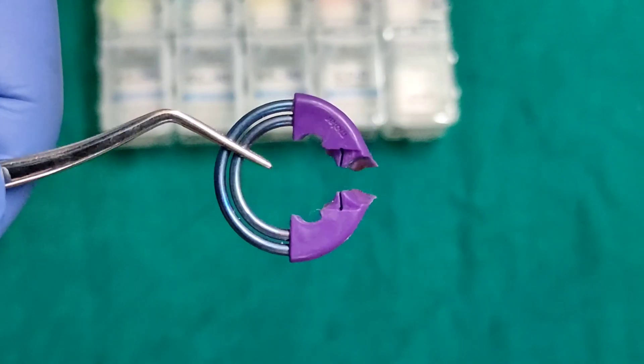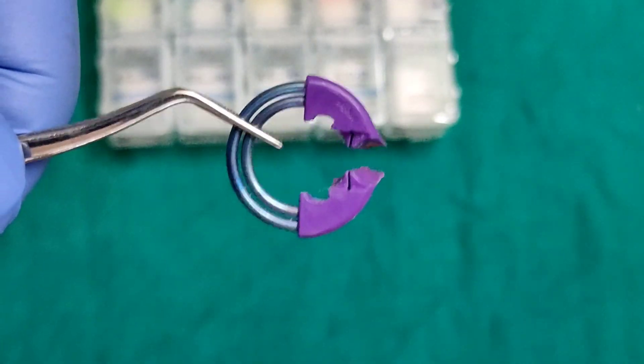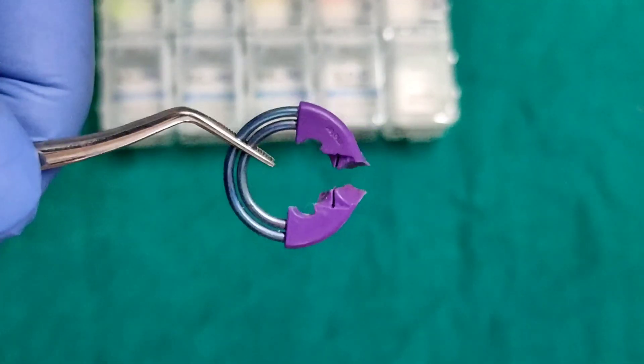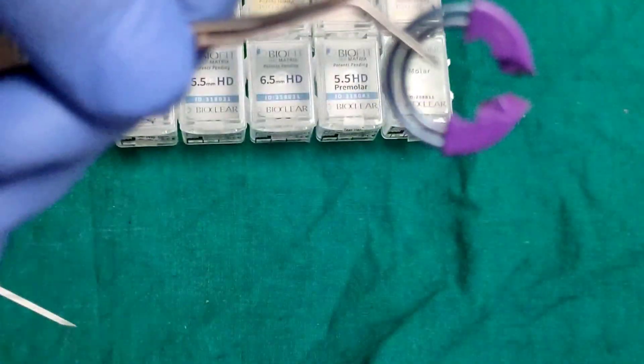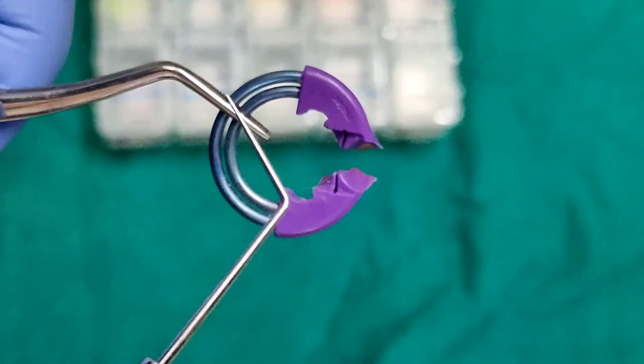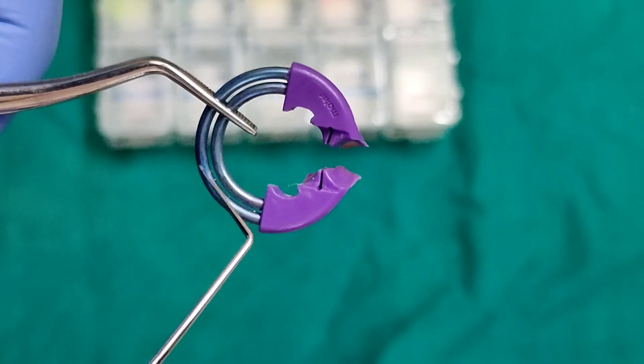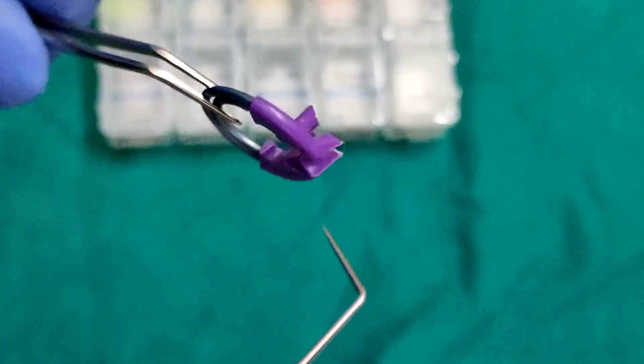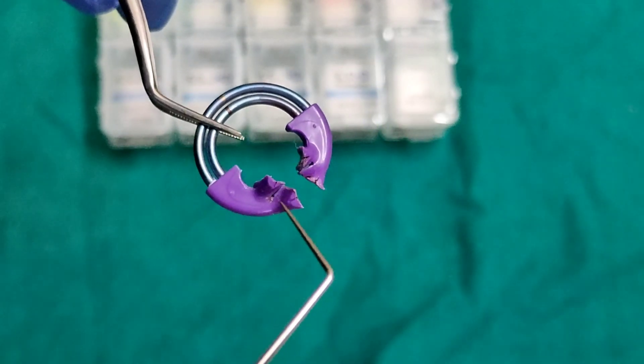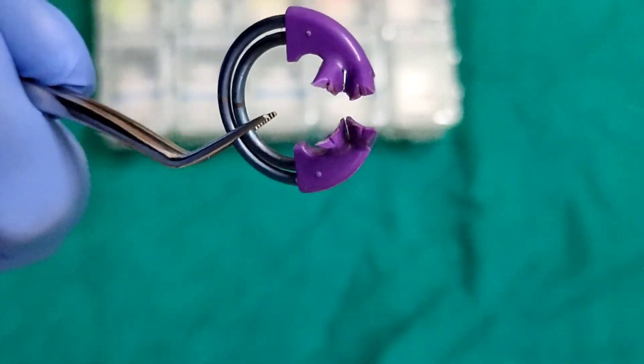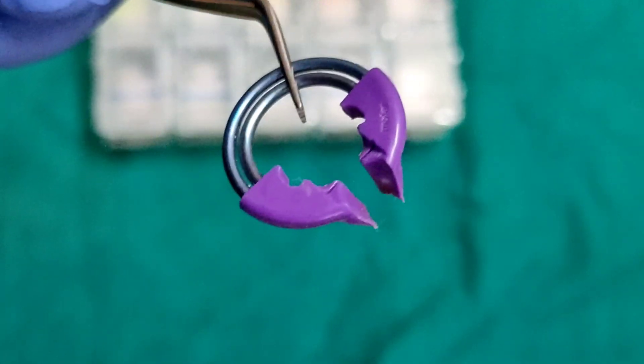Coming to the twin ring. The twin ring in BioClear posterior matrix system consists of two NiTi wires which creates a strong separation force while maintaining their shape and strength for hundreds of uses. It also has adapting hands which ensures a tight marginal seal of the matrix without collapsing the matrix into the cavity preparation.